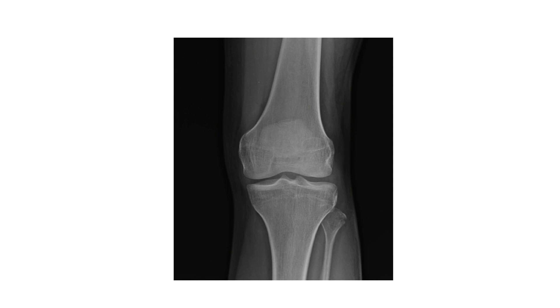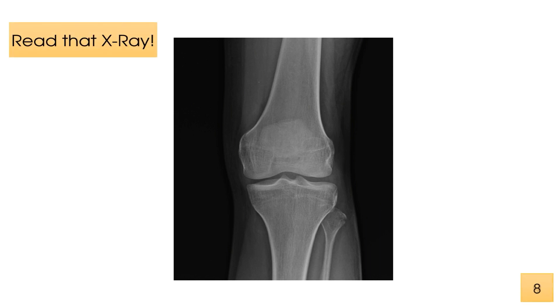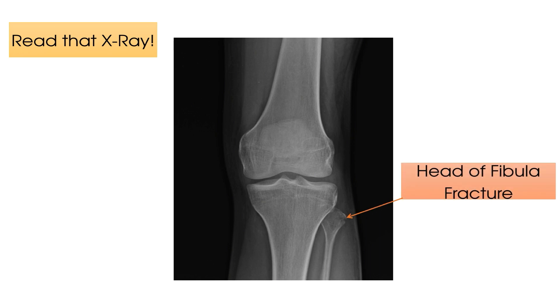Here is X-ray number one. Read that X-ray. Time's up. If you can look closely, you can see that this patient has a very subtle fracture at the head of their fibula.